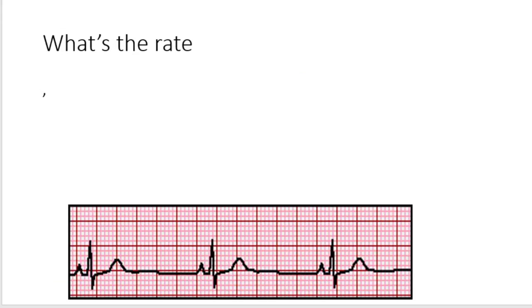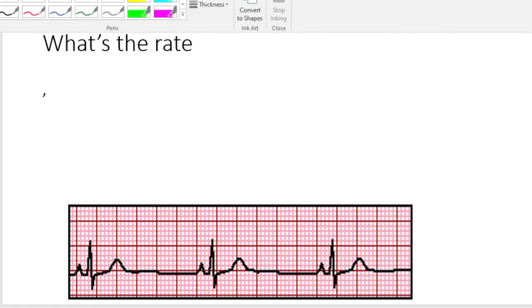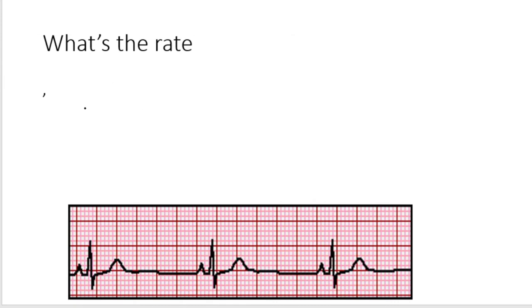Now moving on, we did calibration, then now we need to do the rate. So how do we establish rate on an ECG? Always remember that there are two methods. There is a shortcut, then there is a long cut or a long method.